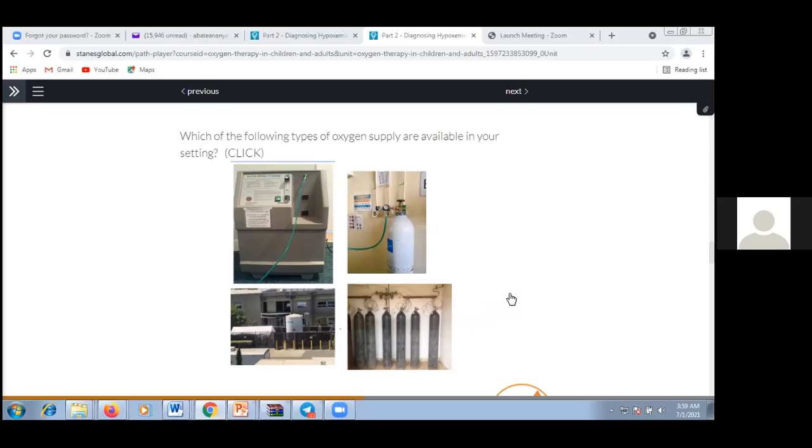So this was actually quite good because we didn't have to transport these big bulky cylinders to the patient's bedside. It also minimized the interruption when we run out of one cylinder until a new cylinder is connected to the ventilator, there's always this gap. So these kinds of things we did manage to avoid, but again, it had its downside.